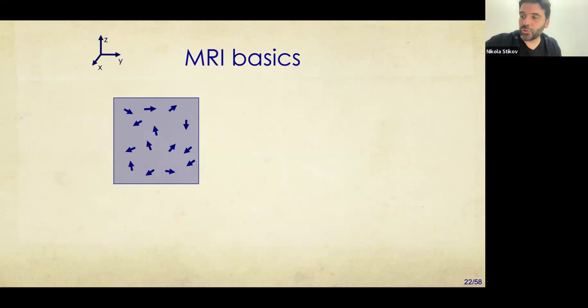And this is where it'll show that I'm an engineer, not a physicist, because I'll be talking in terms that will make physicists cringe. But basically, when you have water, you have hydrogen spins. Turns out that a magnetic spin is a property of every chemical element that has an odd number of protons or neutrons. And in the case of hydrogen, that's simple. It has an odd number of protons, 1. And we treat every hydrogen atom as a small, tiny magnet.